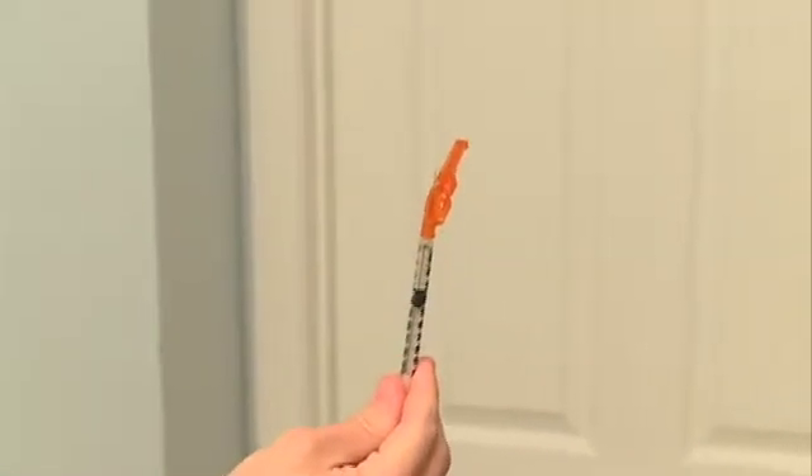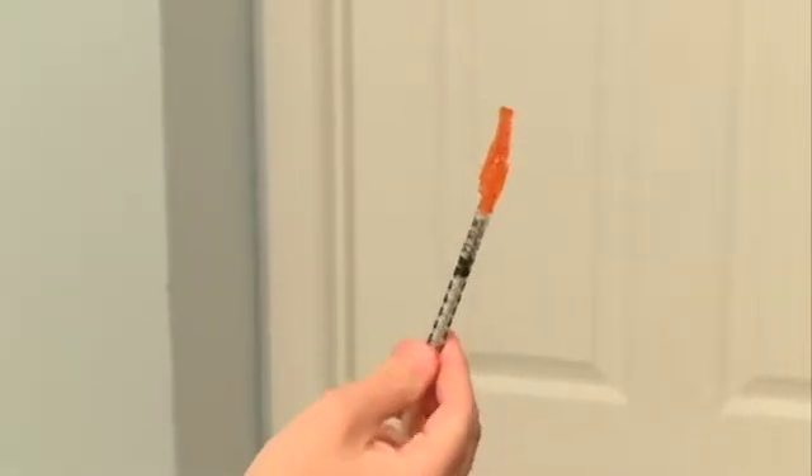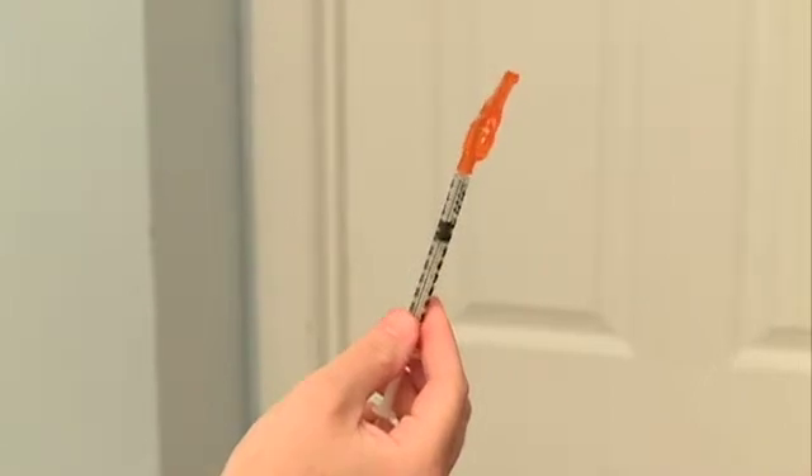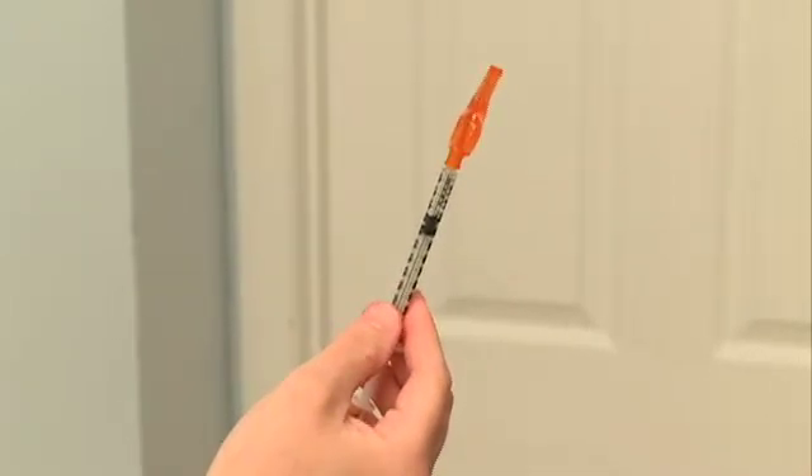Point the needle toward the ceiling and push out any air from the syringe. Be careful not to push out any medicine. Your medication is now ready for injection.